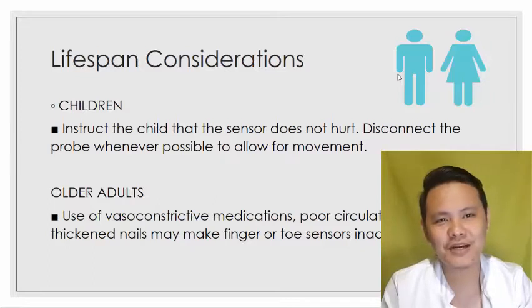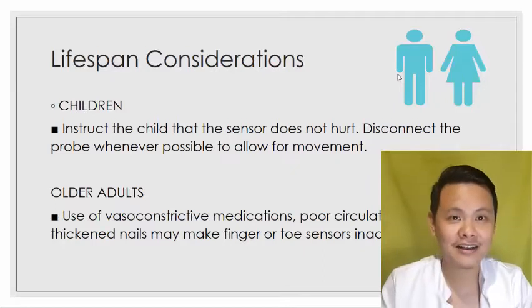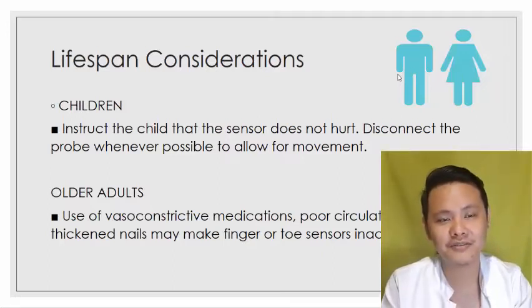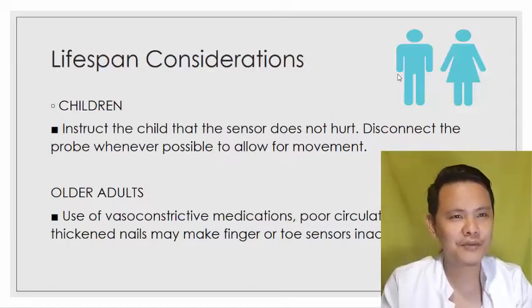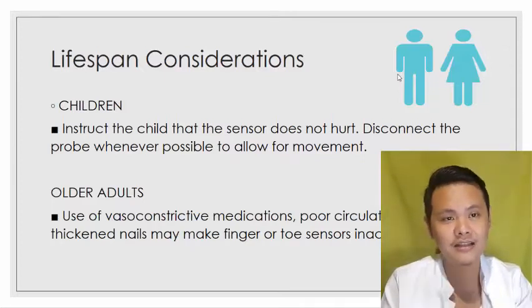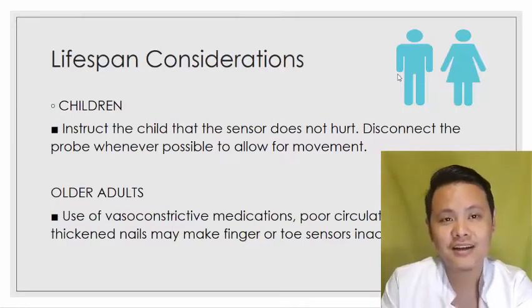Next, for the children, we have to instruct the children that the sensor does not hurt. Ang problema kasi kapag pumasok na si nurse sa may ward or dun sa may room ng bata, minsan natatakot na sila. Kaya natatakot sila pagka nakakita sila na person who's wearing a pure white. Okay, bakit? Because it is because of the upbringing of their mother. Tinatakot kasi ng mga magulang, yung mga bata. So, we have to tell to the children na yung ilalagay natin sa kanila is hindi nakakasakit. Okay? Especially this one is non-invasive. So, we have to tell that to our client na mga bata.